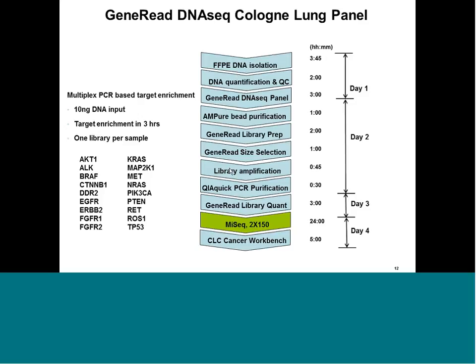So you know this AKT, exon 20, for example, PCR is generated from Mrs. Miller, and that AKT, other AKT, is generated from another patient. And then sequence them with next generation sequencing technology on the same machine, in the same run, multiple patients, multiple genes, and very high density to go very deep.